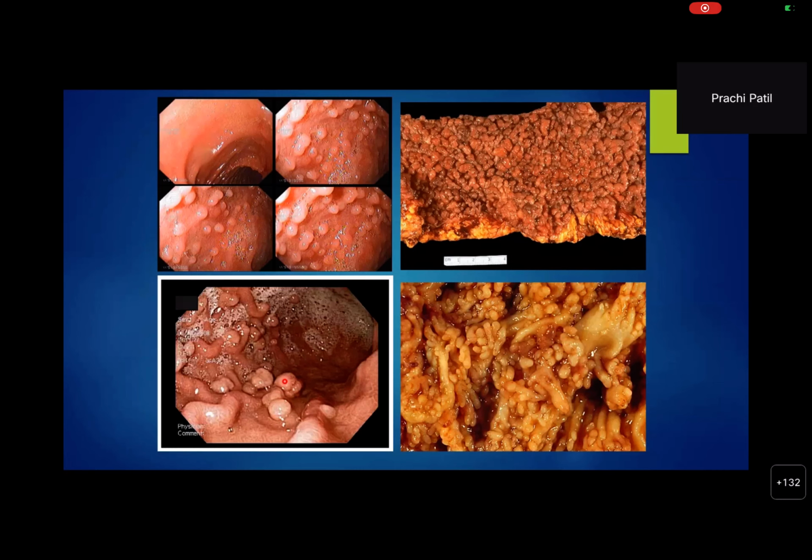And the polyps below, on the left side, are unstructured. I don't know whether they are inflammatory pseudopolyps. Typically these are the types you see with IBD, but the intervening mucosa is normal. Right. Okay. And this one? The right bottom one? The right bottom one again could be FAP, but I'm not sure. Right. It's just a carpet of polyps again. So you would definitely want a histopath of all these cases, correct?